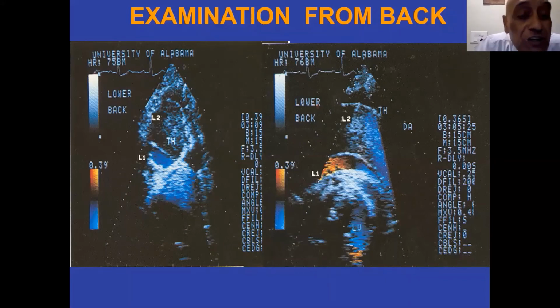Sometimes this will also be seen in PDA. So if you're looking at a pediatric patient with a flow reversal, then try to image the PDA properly, to actually say that this is due to PDA.